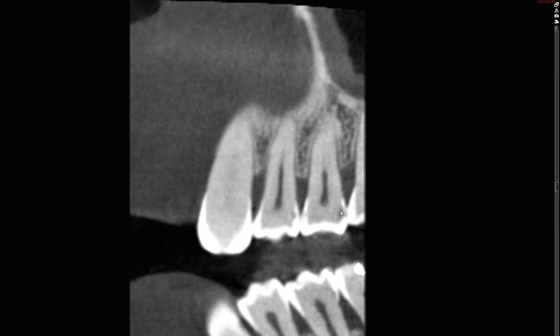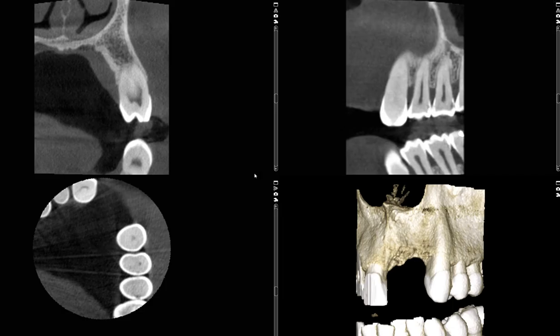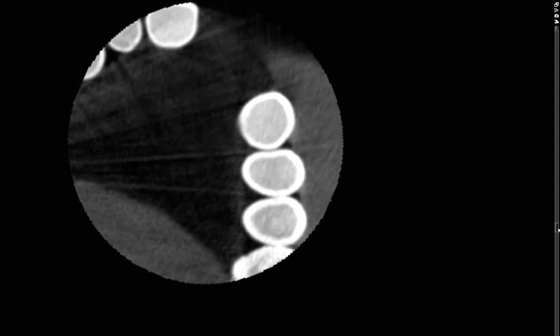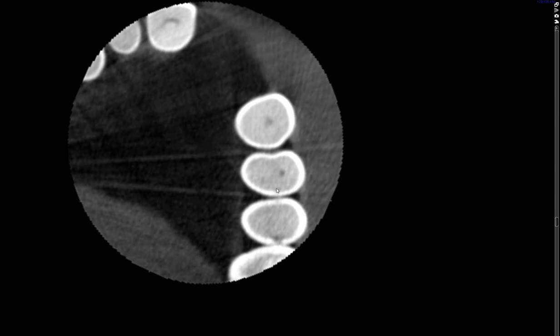Now let's take a look at this caries on the axial view. Right there — you can see demineralization and this almost disrupted pattern of the enamel layer, with radiolucency into the dentin. Now let's look at number 12, which was another suspicious area, but it's certainly not as clear or obvious. This is something I'd recommend taking a bitewing radiograph to confirm. On the axial view of the definitive lesion, you can see that right at the contact it penetrates through the full thickness of enamel, and it's also spreading buccolingually.